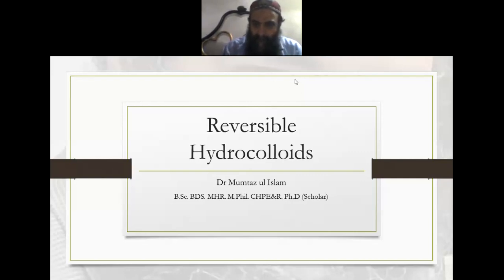I am Dr. Mumtazul Islam, and we are discussing reversible hydrocolloids. Reversible hydrocolloids, which are used in dentistry, are mainly for taking impressions.